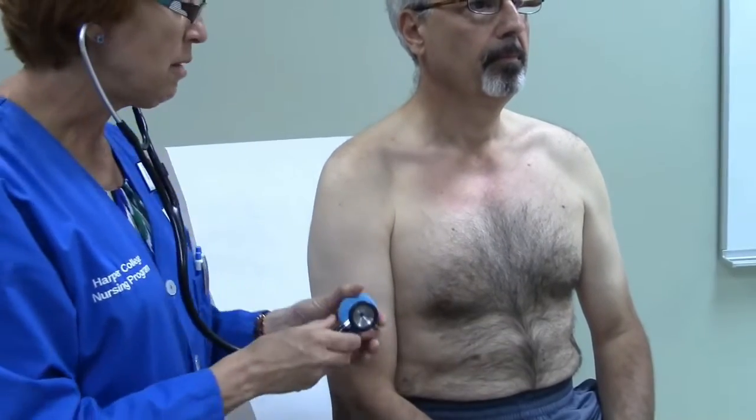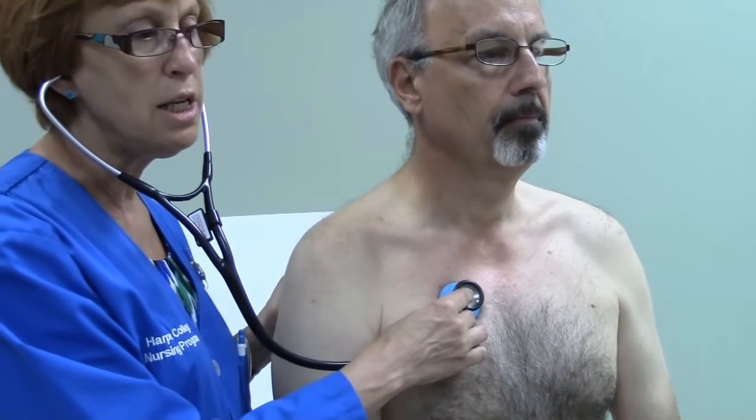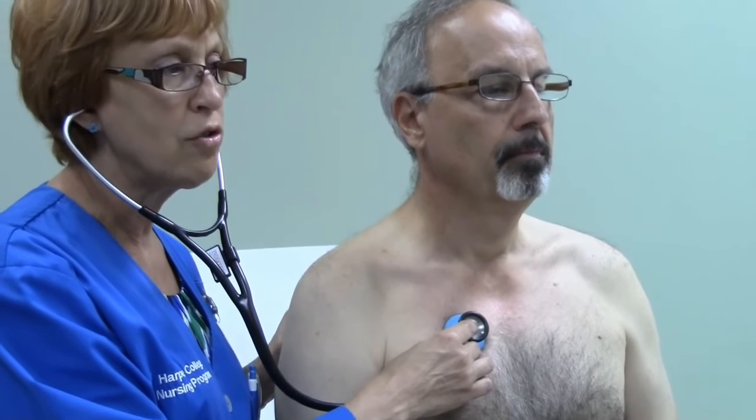Make sure that you have your stethoscope set up the right way. Start in the aortic area. Just have the person breathe normally. And I'm listening for the S1 and the S2, the lub-dub. And I'm listening for any clicks or extra sounds or murmurs.